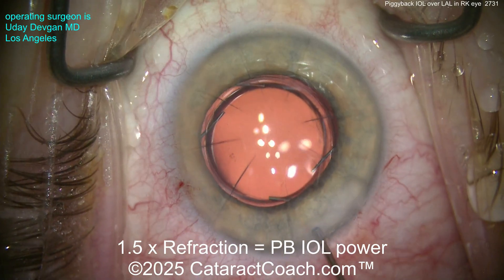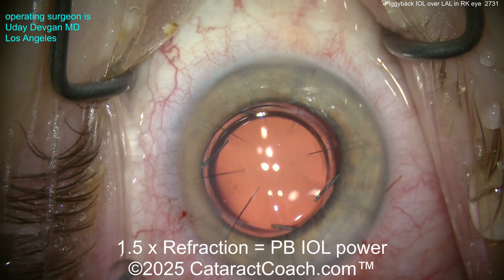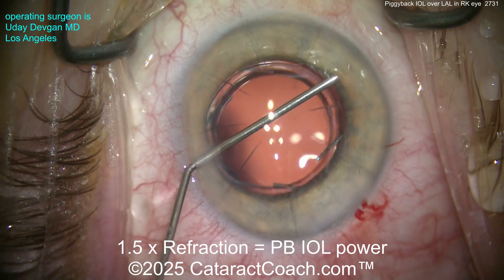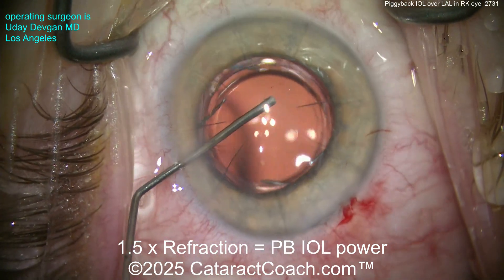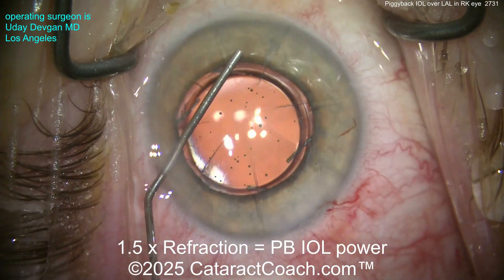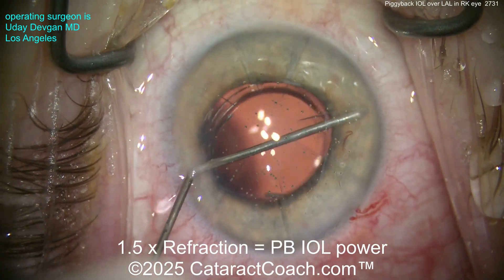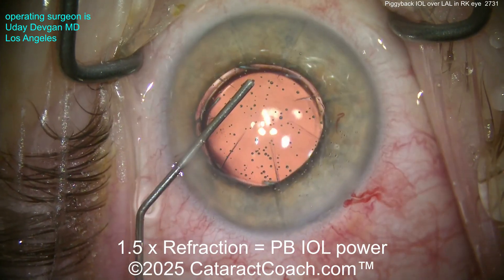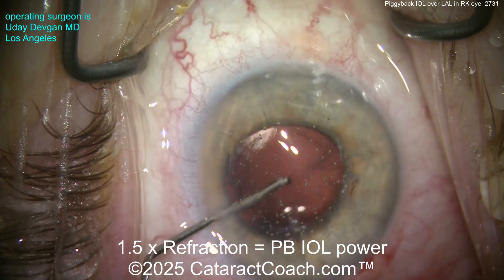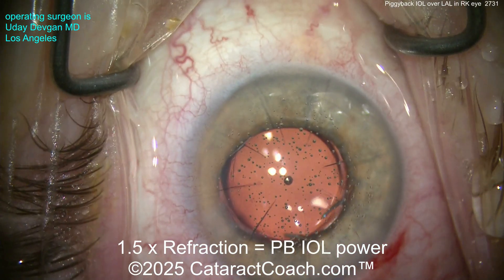On the minus side it applies the same way, although some people tend to slightly undercorrect. If the patient ends up minus two post-op and you want to add a piggyback lens, you'd put in a minus three based on this formula — but some people say undercorrect a little, maybe do a minus two and a half. You'd rather leave the patient with some myopia; you don't want to make them hyperopic. Generally, 1.5 diopters on the IOL equals about one diopter at the cornea or spectacle plane. You don't have to worry much about vertex distance when dealing with such low powers of one, two, or three diopters — there's really not much effect from that vertex change.